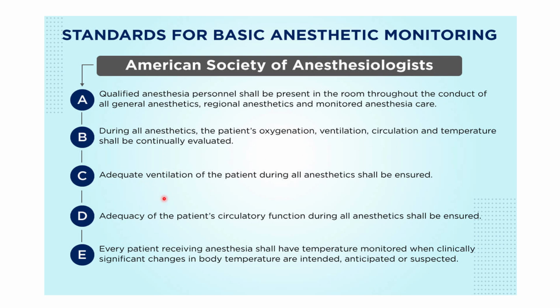Adequate ventilation of the patient during all anesthetics should be ensured.